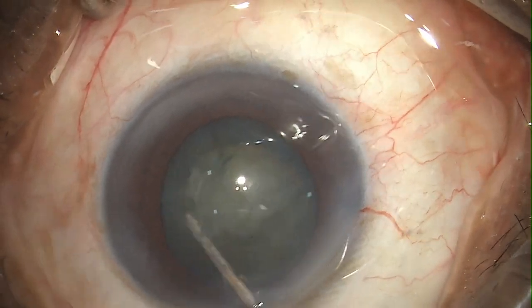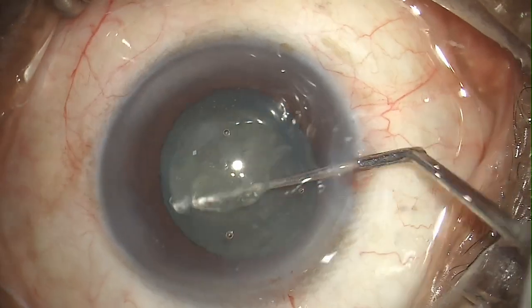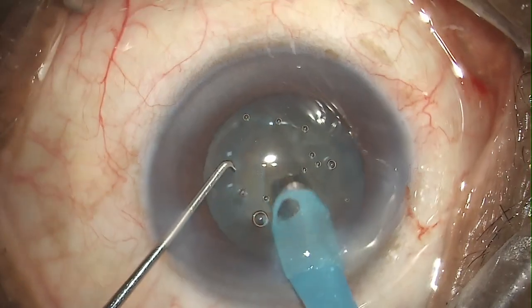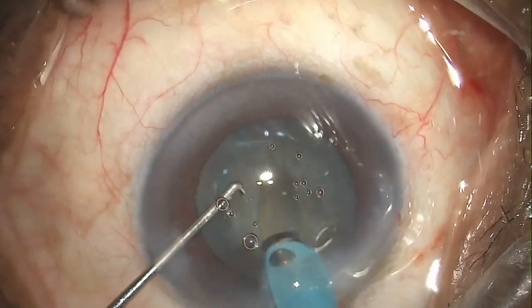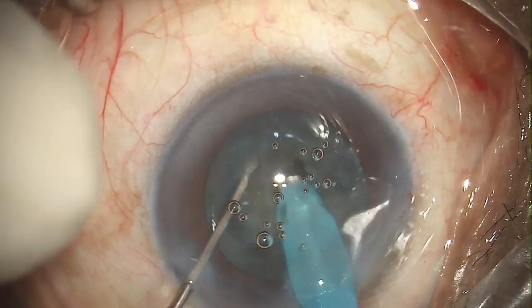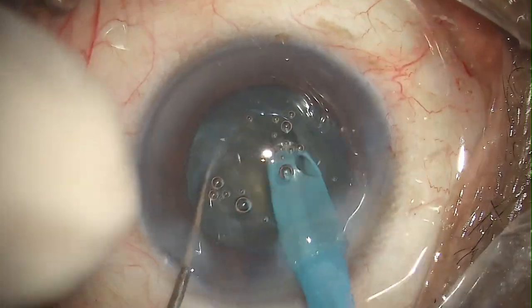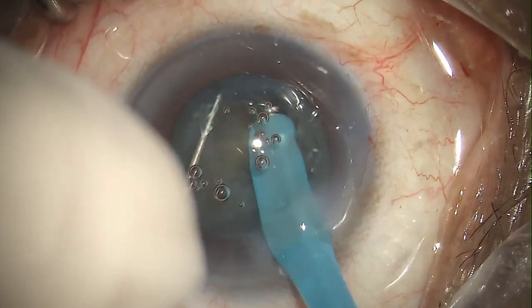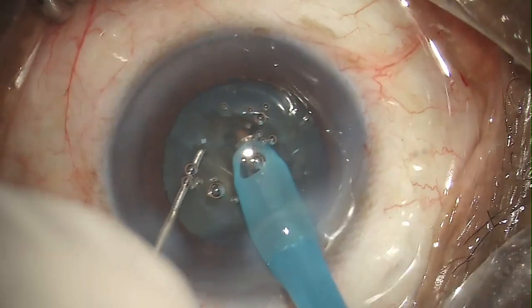One of the best and easy techniques to handle such a soft cataract is to get the nucleus out of the bag, bring it to the anterior chamber, and easily aspirate it — because it's a very soft cataract — but I didn't go for that in this case. The second technique is to make a deep trench, divide the nucleus into two halves, take one hemisphere into the anterior chamber and emulsify it. I attempted this, but we can see things are getting cheese-wired easily, so that was not very successful here.